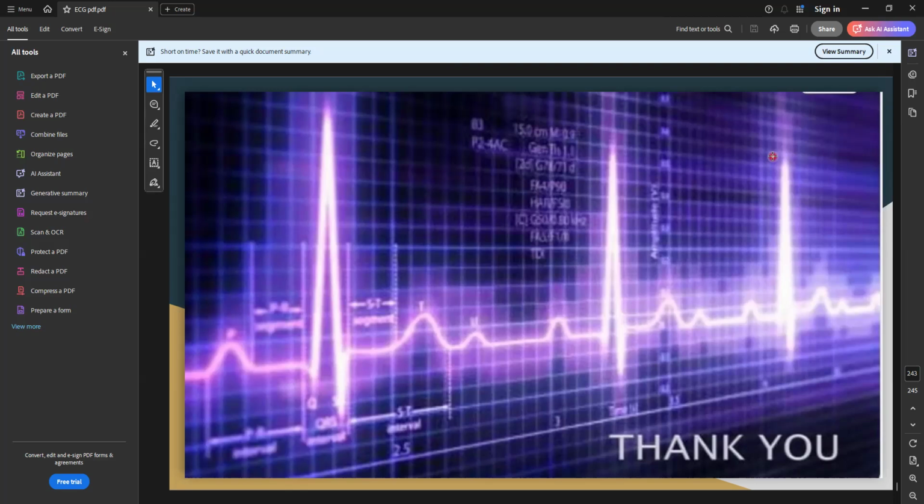You can't. These are some of the features. Once you have diagnosed the patient as hypothyroidism or hyperthyroidism, these are the additional features which you can see in those patients' ECG. With the ECG changes, you can't diagnose the patient as hypothyroidism or hyperthyroidism. You have to go for the thyroid profile. Okay, thank you, ma'am.